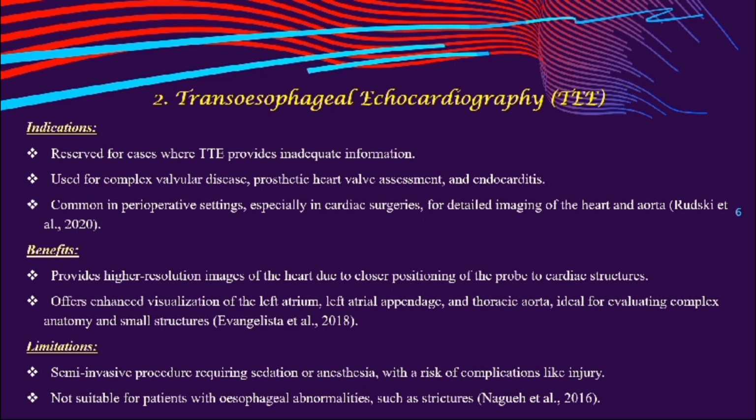Benefits. Provides higher resolution images of the heart due to closer positioning of the probe to cardiac structures. Offers enhanced visualization of the left atrium, the left atrial appendage, and thoracic aorta, ideal for evaluating complex anatomy and small structures. Limitations. Semi-invasive procedure requiring sedation or anesthesia with a risk of complications like injury. Not suitable for patients with esophageal abnormalities such as strictures.